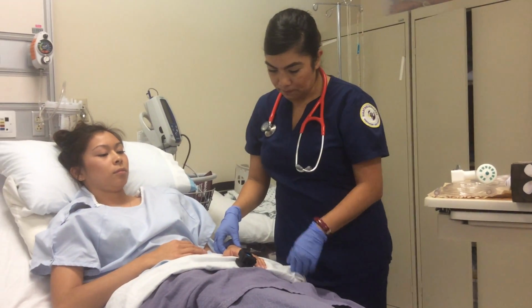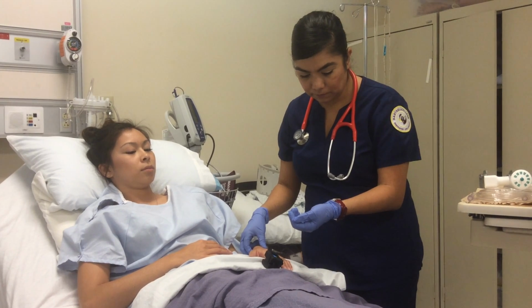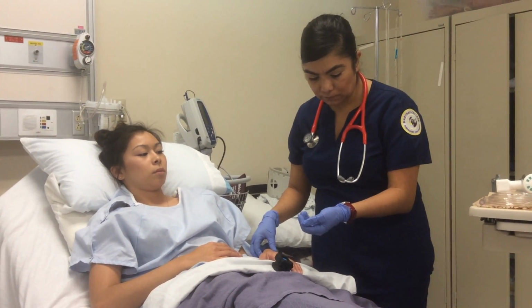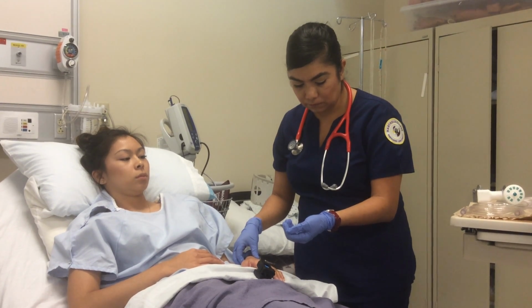And then you're going to blow out as hard as you can. Like you're going to blow out candles, but a really big one burst. Okay, so we're going to do 2 more. We're going to pick the best one. But you reached it.